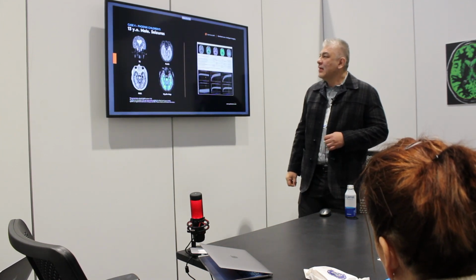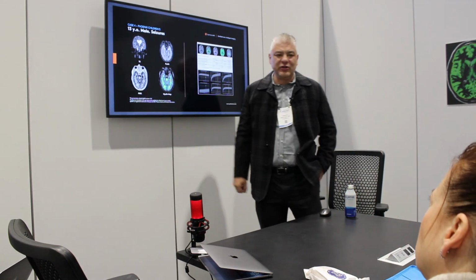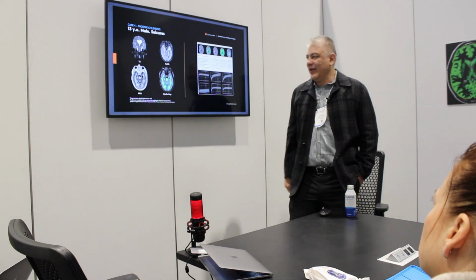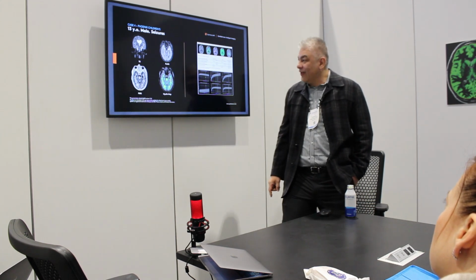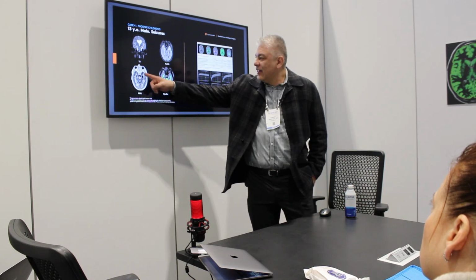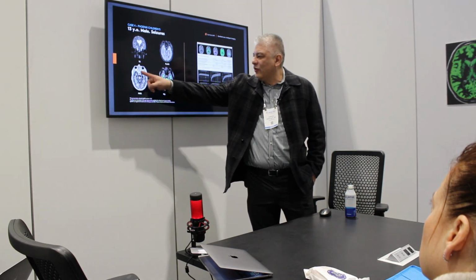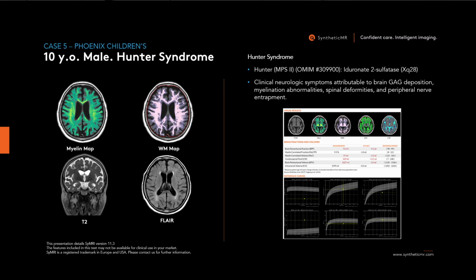Next, this is a patient with seizures, and obviously everybody's going to see that there is some mesial temporal sclerosis on the left. Very obvious, anybody can make that diagnosis. However, when I ran the PSIR, the anterior temporal lobe, you compare it to the right. This cortex is irregular, smooth, and flat, as opposed to how the normal cortex looks elsewhere in the brain.